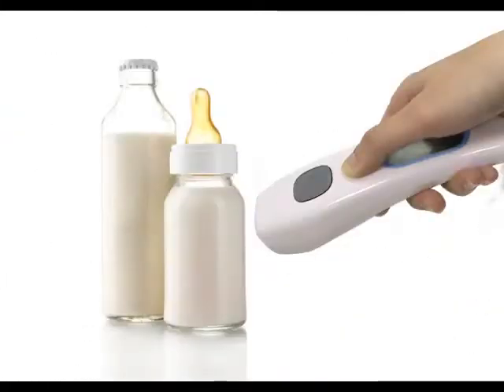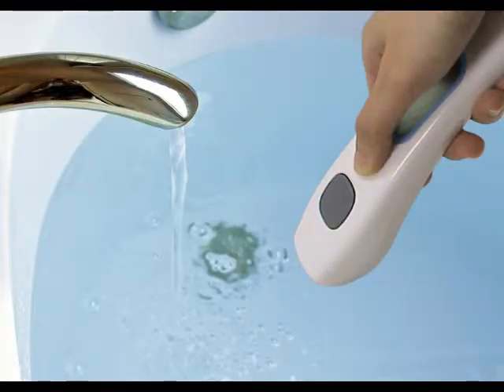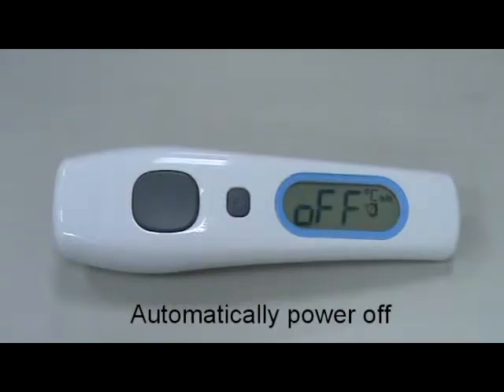Surface mode can be used to scan a baby's milk or a baby's bath water temperature. The thermometer will automatically shut off after 1 minute of inactivity.